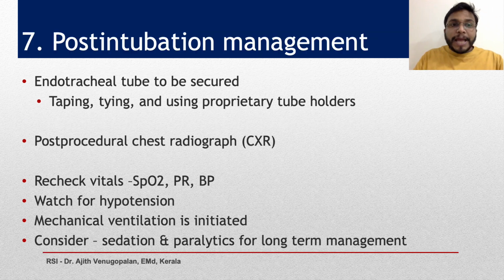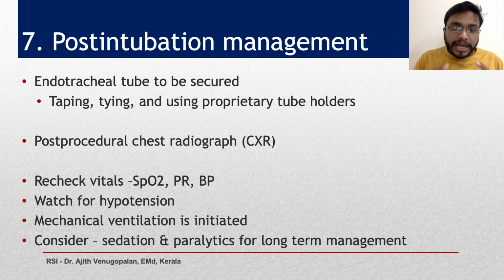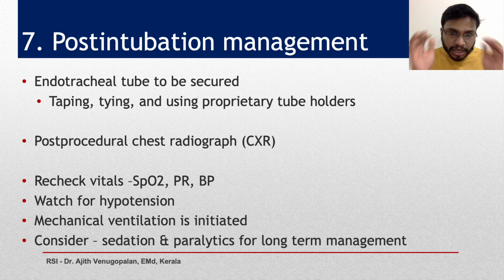Now coming to the next and last crucial step, post-intubation management, which starts with tube fixing. You have confirmed the position with ambu inflation. Someone has inflated the pilot balloon and the cuff is in position. Cuffs help us mainly in preventing aspiration. And now you have confirmed with all the 5-point auscultation. Now you have to fix it.